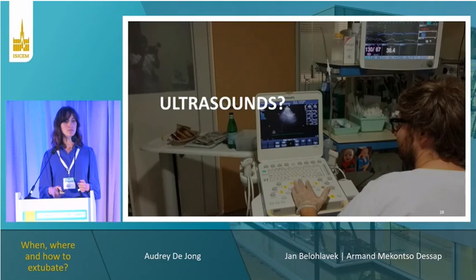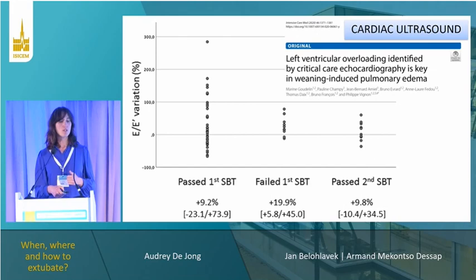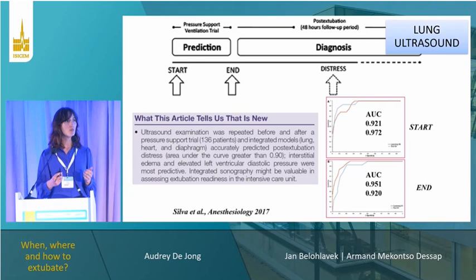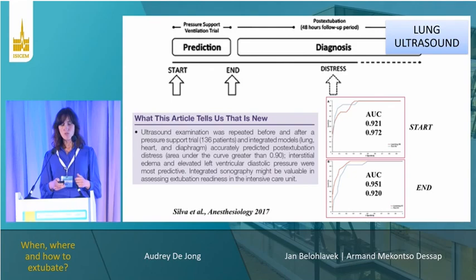What about ultrasounds? Ultrasounds are very useful, and there are many, many recent publications. I cannot detail all, but what we can remember is that cardiac ultrasound should be almost systematically performed during SBT, or at least assessment of cardiac function, for example, with BNP, and also lung ultrasound. And the best is to combine all the techniques that we know, cardiac, lung, and diaphragm assessment during SBT to optimize the prediction, as you see here in this study, of failure of extubation.